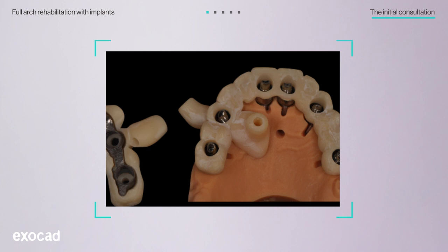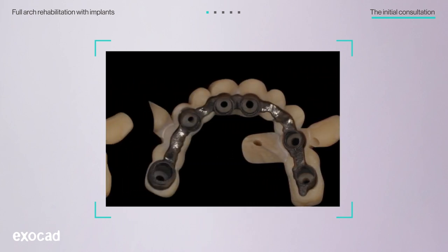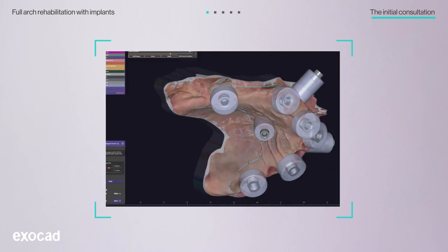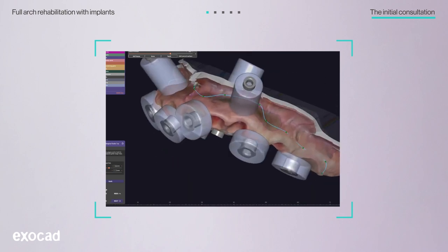Exocad Dental CAD software is capable of using the implant positions from Exoplan to design a screw-retained provisional restoration for the implants' immediate loading. Using this, the lab prepared the surgical guide and provisional restoration for the next appointment.